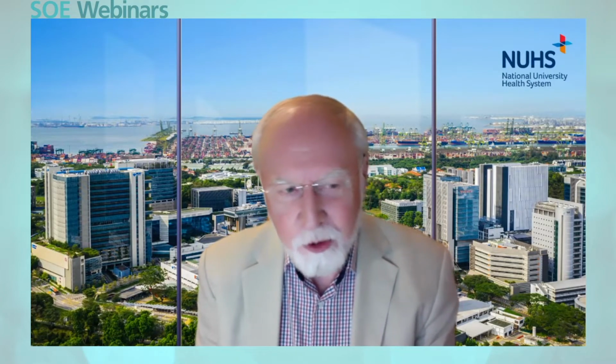But while I was at Moorfields, what we found particularly useful was not just having straightforward dark adaptometry, but also dark adaptometry which tested dark adapting cones as well as dark adapting rods, which was a system developed by Chris Hogg and Jeff Arden. And that enables the detection of a disorder where you lose the inhibition. Usually, as the rods start to dark adapt, they suppress the function of the cones, and then the cone thresholds increase.